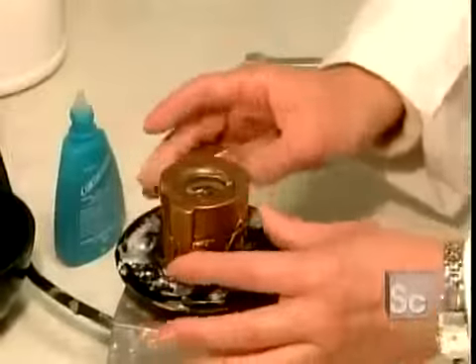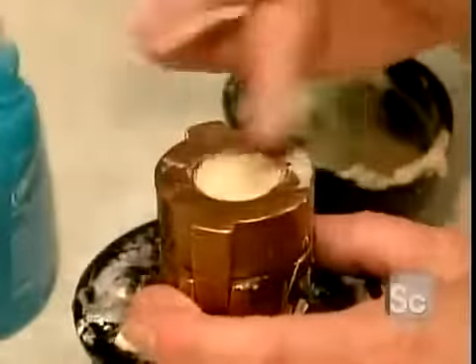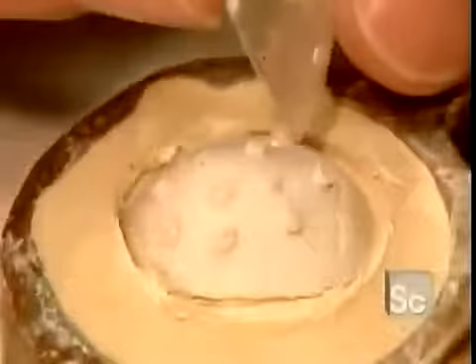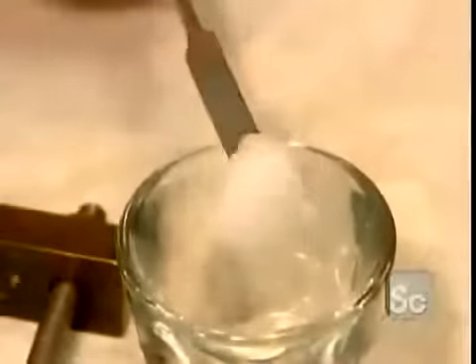They place the impression in a mold and pour in a type of plaster. When the plaster is hardened, they remove the impression tray and then the impression itself. What's left in the mold is a plaster replica of the socket.